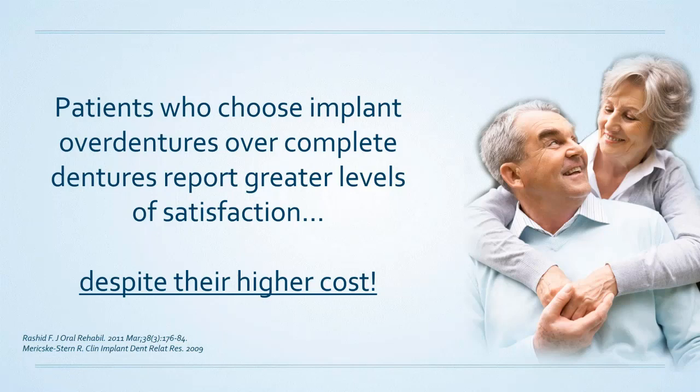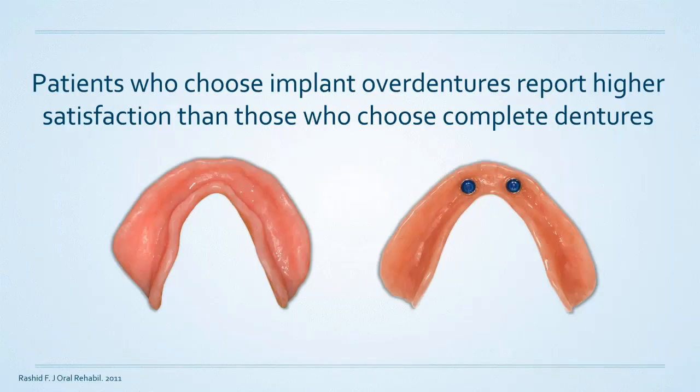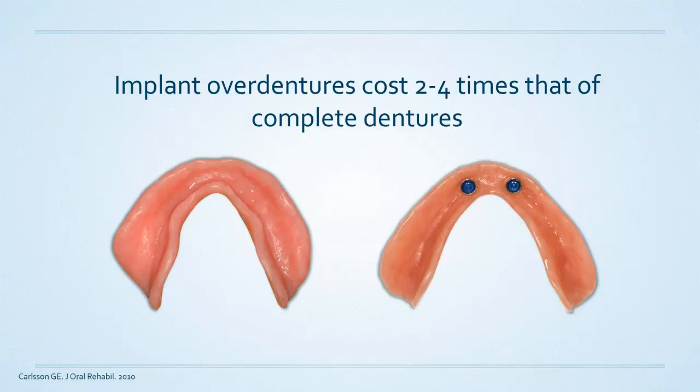Said by no one. The reality is the vast majority of patients report an immensely higher grade level of satisfaction for their dentures with implants. And yes, this is the statement that I just made. But the big question is that, yes, they are more expensive.